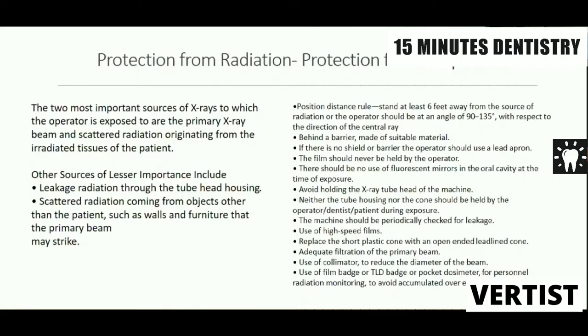The machine should be periodically checked up. Use of high-speed films. The plastic cone which is commonly available in the machines should be replaced by an open-ended lead-lined cone. Adequate filtration, use of collimator, use of the TLD badge to monitor how much radiation you are exposed to.